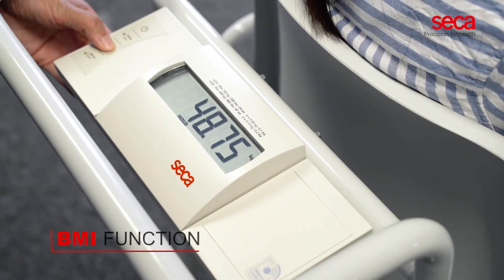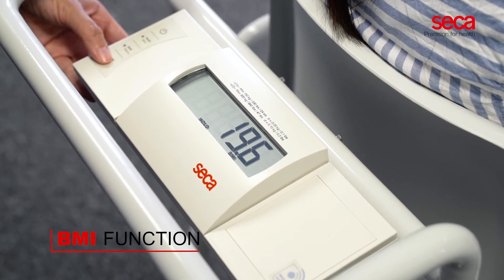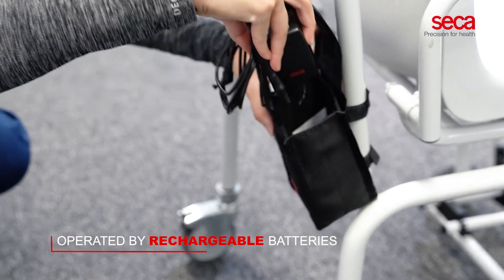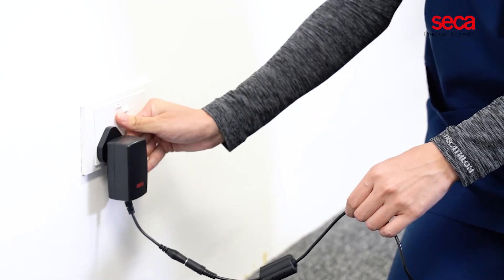Body mass index can be calculated via the BMI function when the patient's body height is entered. The Sika 954 is operated by rechargeable batteries. The convenient pouch at the back of the scale keeps the power adapter in place.